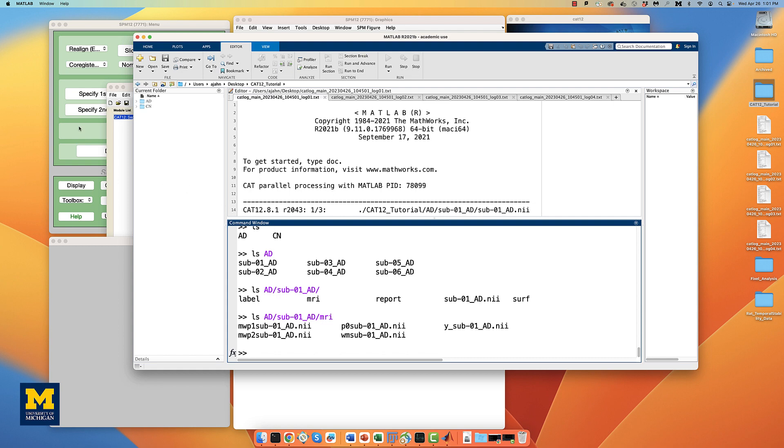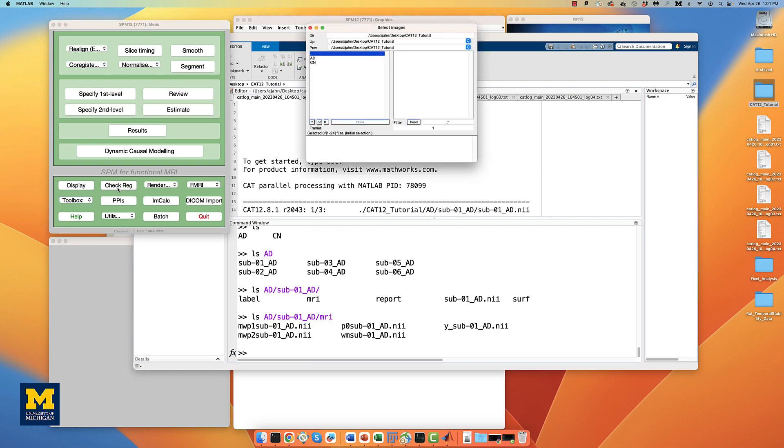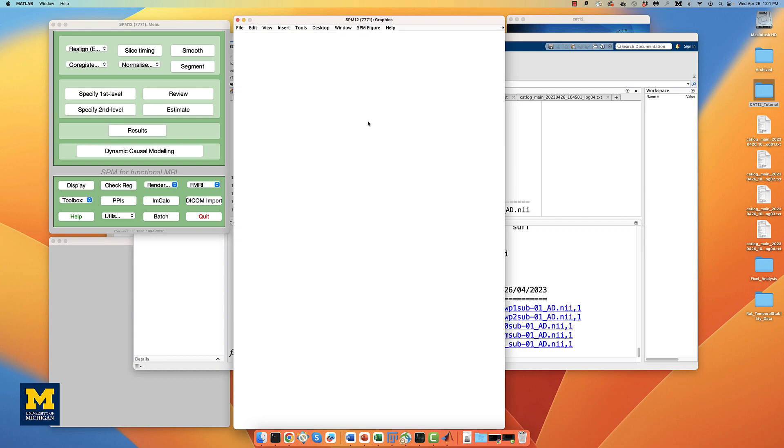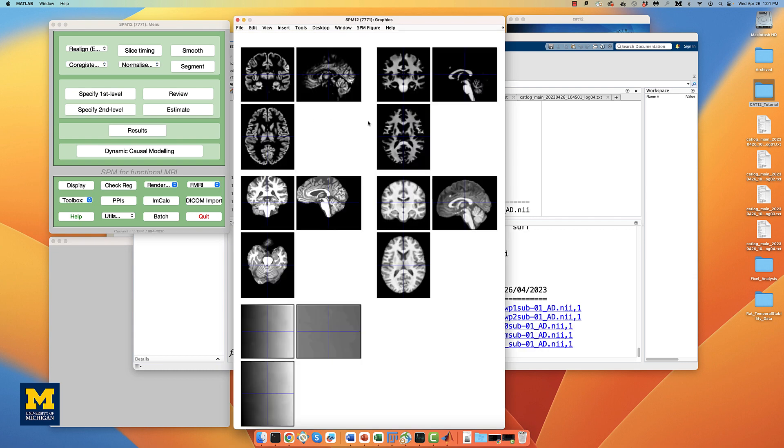From the SPM12 GUI, click on check reg, and then select all of the images in the folder for one of the subjects in their MRI subfolder. This will allow you to view them side-by-side.